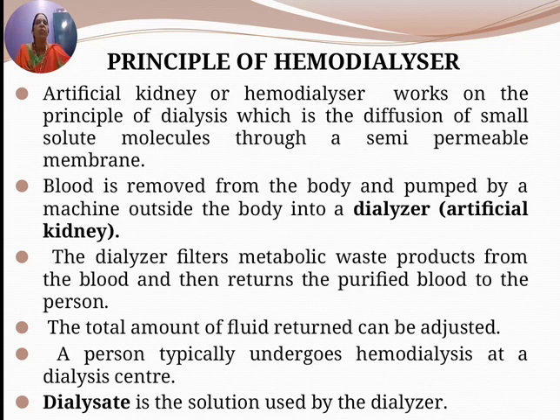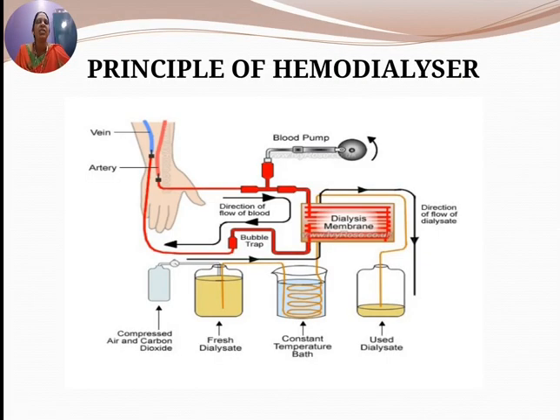Okay, when we look at the picture of the hemodialyzer, you can understand. Here is a picture of a hemodialyzer. The blood is sucked from the artery and pumped into the dialyzer unit, which consists of a series of membranes.